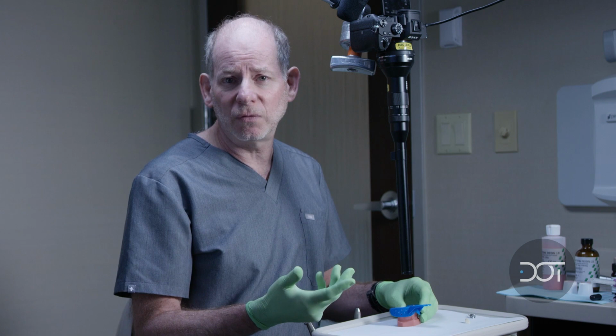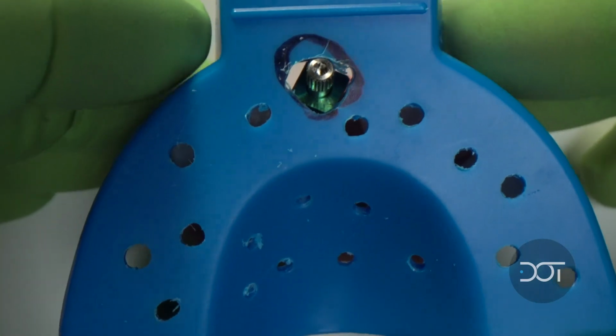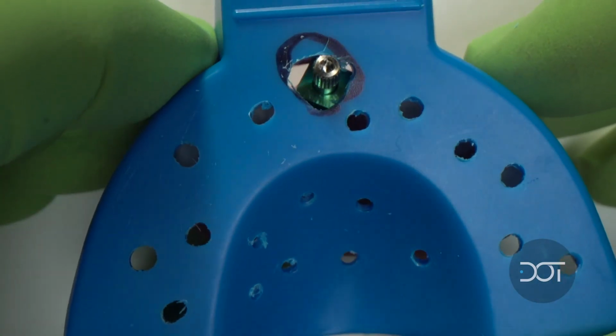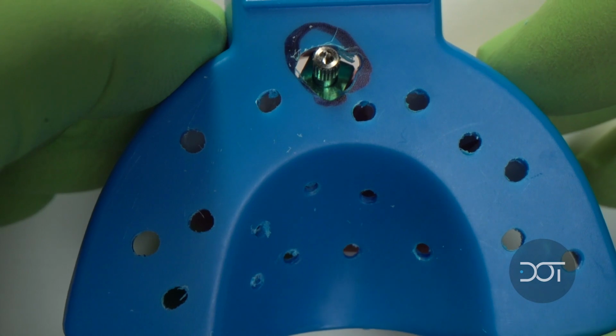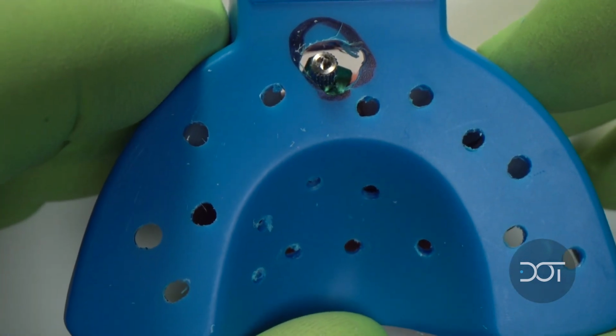In the mouth, I'd be using a full arch tray, but for this model, it's only a 6-tooth model, so I'm just using a little anterior tray. Okay, I try it on and it feels like it has nice ability for the tray to go through the pin. So it's ready for me to get ready to start taking the impression.